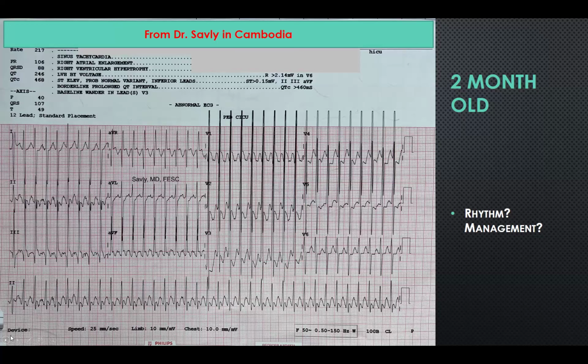It's a very, very important safety feature. And the other thing I'll mention, since we're talking about getting electrocuted, and I think most of you know this, but I'll just remind you, you cannot get shocked by an internal defibrillator going off. So if you ever come upon a patient who has an ICD and the patient goes into VF or whatever, and you're starting to do CPR, it's safe to touch a patient who has an internal defibrillator, even during an internal shock.